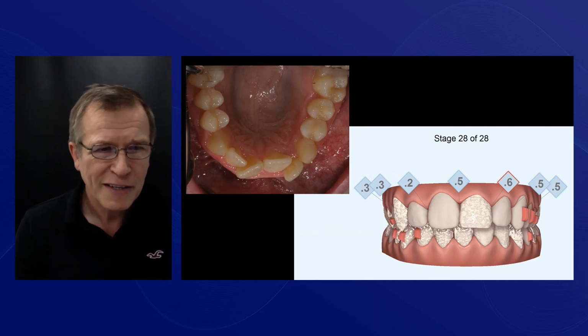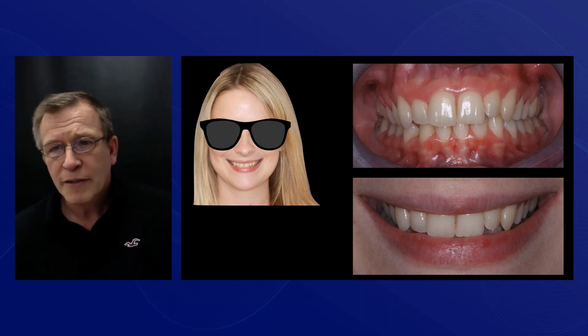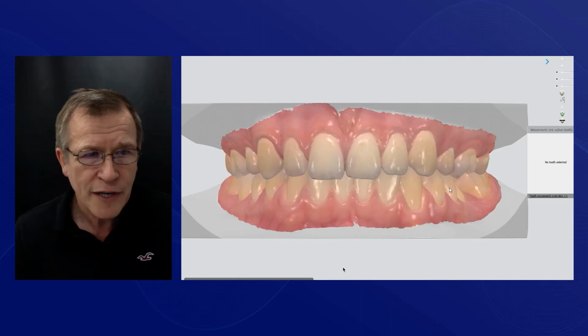So much better. In the old days, I used to have to saw the teeth out, etc., to be able to do this. So here she is, just 10 months later, very happy. Obviously, there's room for improvements in lots of different ways, but I think this is a very acceptable and very reasonable result, and much better than taking a bur to this lovely young girl's teeth.